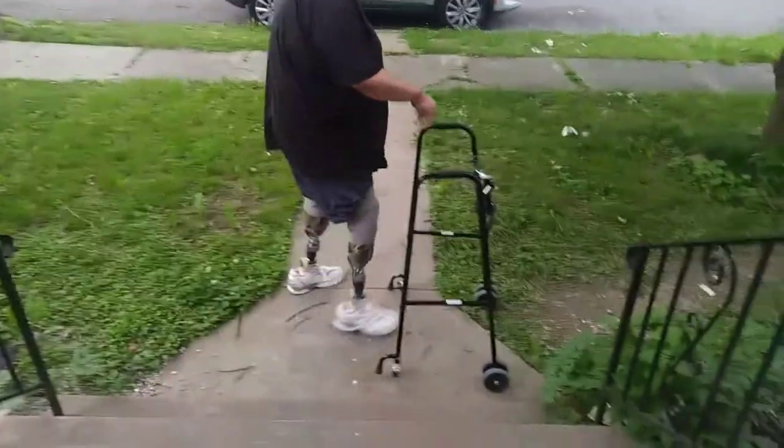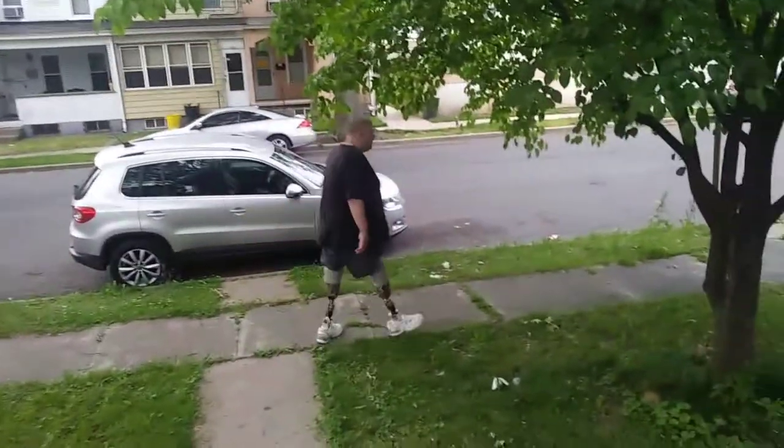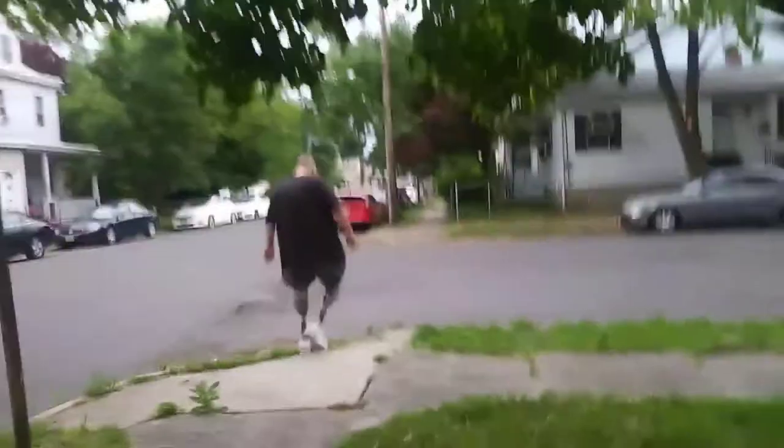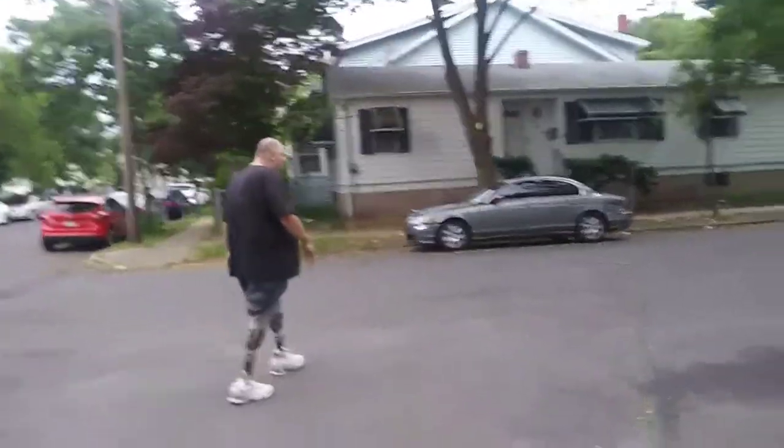I'm going to try and walk with these. Go to the right. Now these things, I'm supposed to be able to turn on a dime with them, but so far they are.